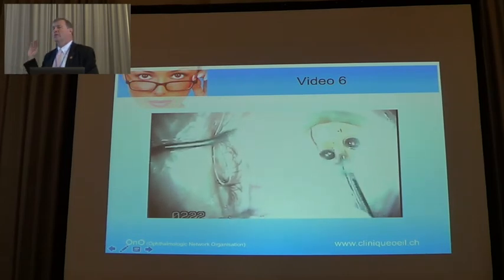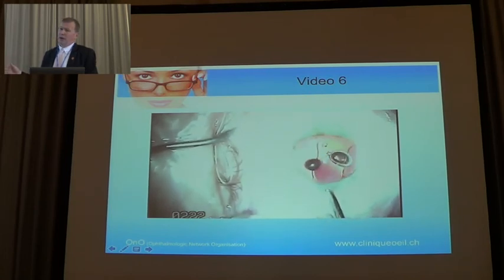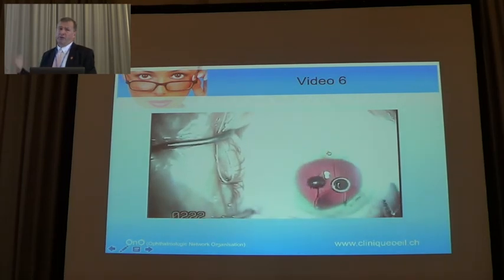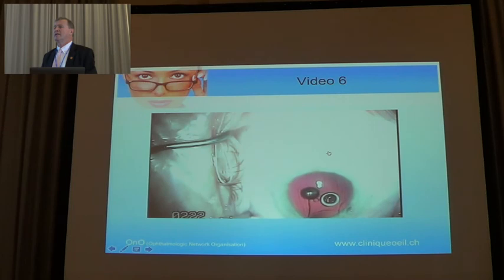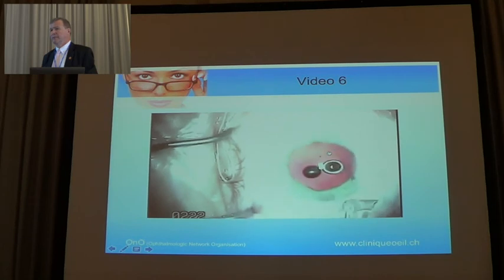And now, with this technique, which is quite better than before, after 1-2 months, if the people are not happy with a trifocal or toric IOL or any problems, you put in a simple lens, you give the money back to the people, and they are quite happy with you. Thank you.